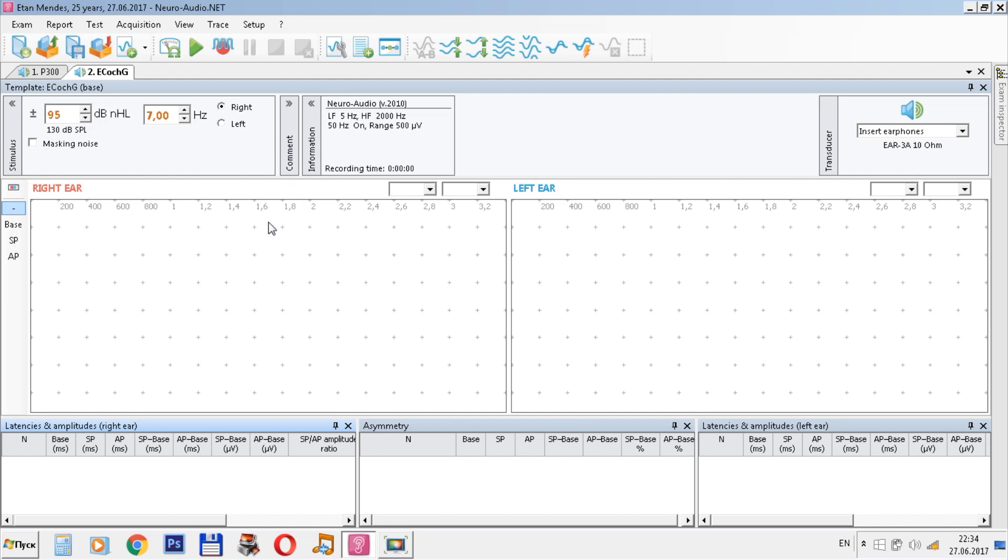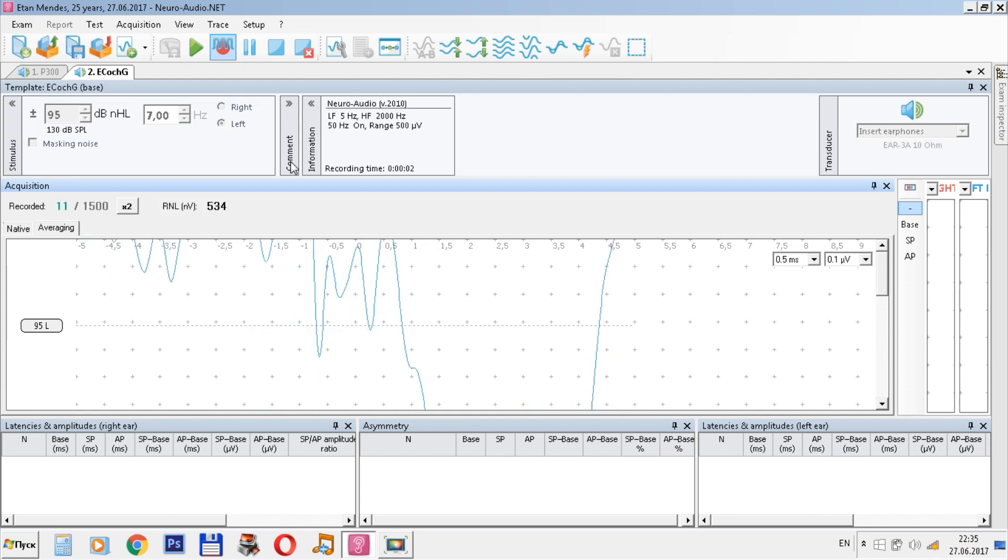Now we can choose the necessary side of stimulation. Check the impedance. Active is plus, it's OK. Check that you use insert earphones and start acquisition. You can see the process of stimulation and averaging. See the curve. Ask the patient to relax maximally and close their eyes.